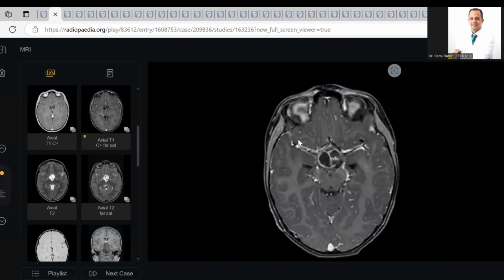What is your next step? Okay, so I would like to inform the findings to the referring clinician. I would send the patient to neurosurgery MDT.